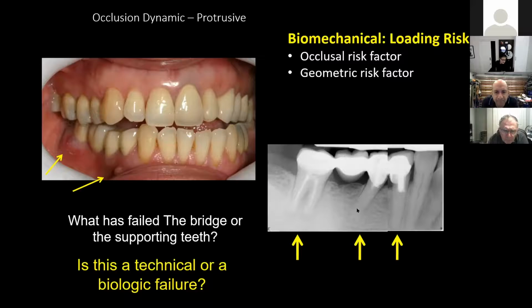And then someone could have done orthodontic treatment, moved this tooth into a better position, or even removed this tooth and placed 2 implants to reduce the loading in that area. That would be fine. Okay, that's the case, that's a better long-term stability.